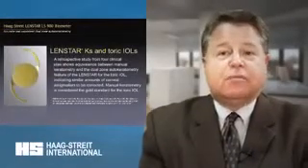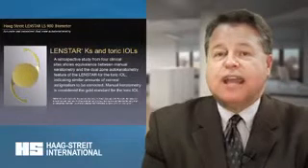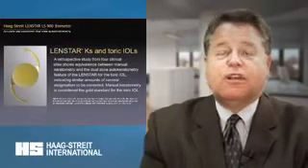There was recently a paper written by Bobby Osher, Kerry Solomon, and myself showing equivalence between the LENSTAR and manual keratometry. And again, manual keratometry is considered the gold standard by most of us who use this IOL, and also the manufacturer who makes it.